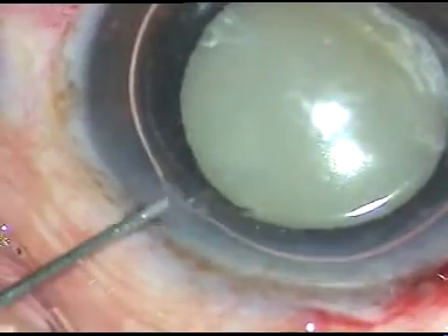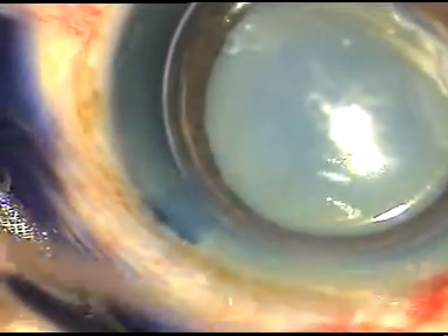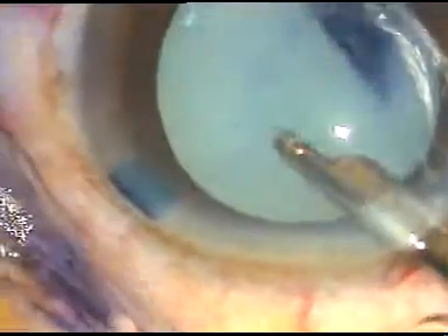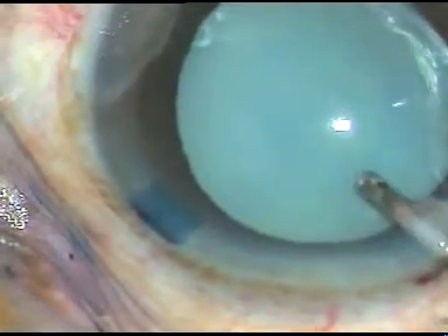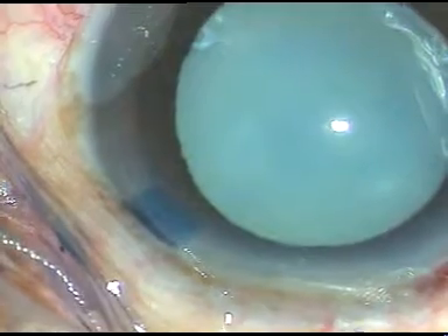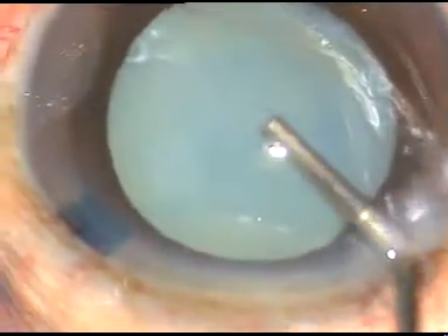We have taken up this case for surgery. By this time, all the incisions have been made. And now, trypan blue dye is applied over the anterior capsule of the cataract lens. The dye is washed out. Now it is time to inject viscoelastic substance — HPMC. Hydroxypropylmethylcellulose is being injected into the anterior chamber.